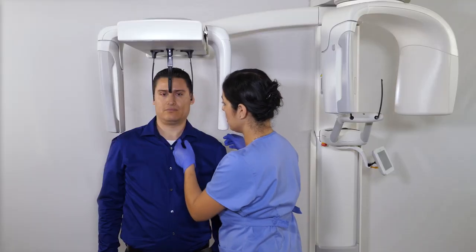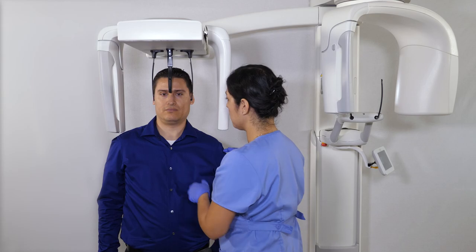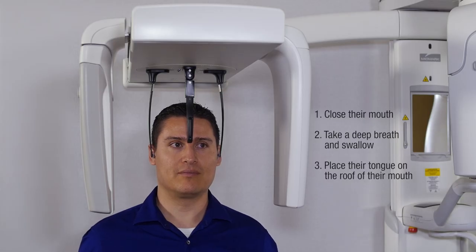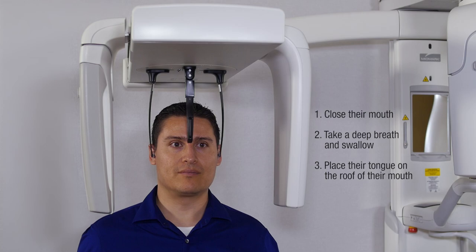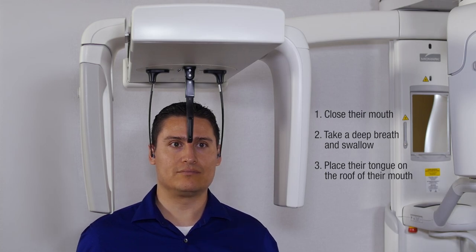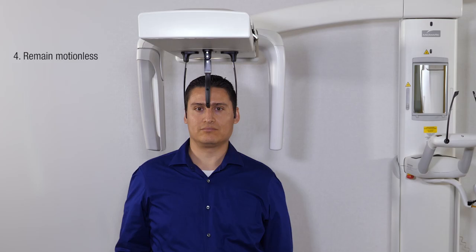With the patient properly positioned, ask the patient to close their mouth, take a deep breath and swallow, place their tongue on the roof of their mouth, then remain as motionless as possible until the device stops moving and they are instructed on what to do next.